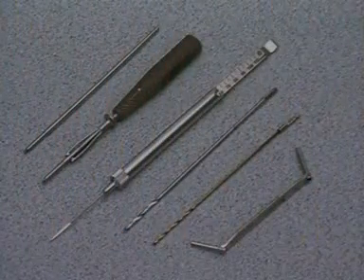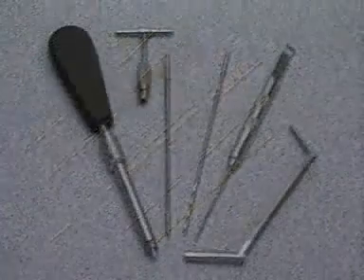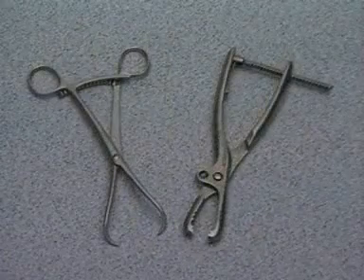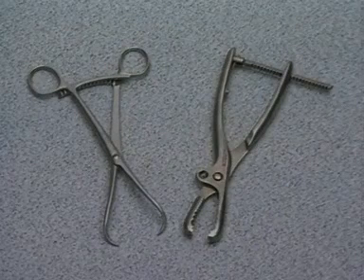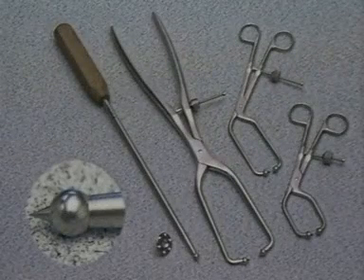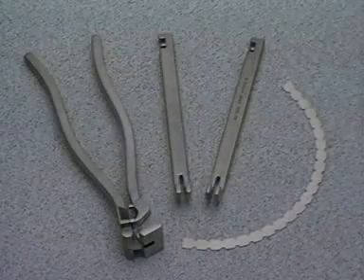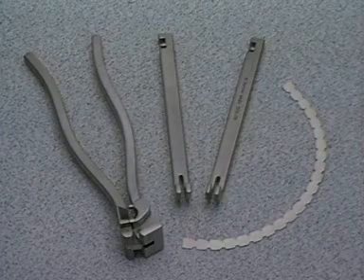For this exercise, we'll use part of the 3.5 instrument set. These are the needed instruments for insertion of the 6 mm Schanz screw. We also use the pointed reduction forceps and the Farabeuf clamp. These are the necessary pointed ball-tipped instruments, bone holding rod with spiked disc, and three various pelvic reduction forceps. The template serves as a model for bending the plate with the bending pliers for reconstruction plates and the bending iron.